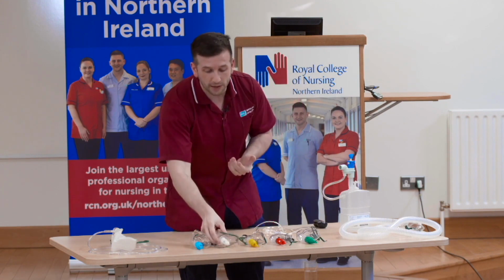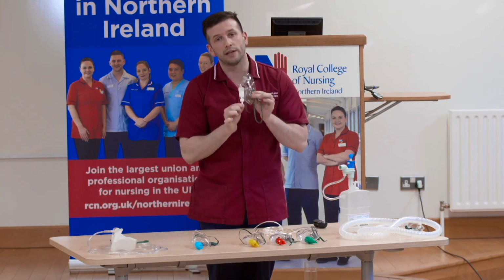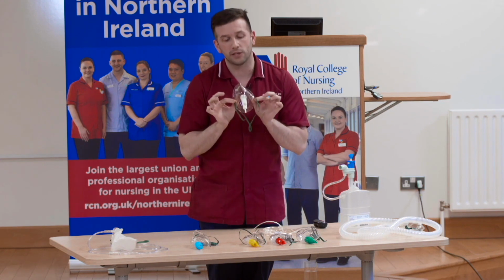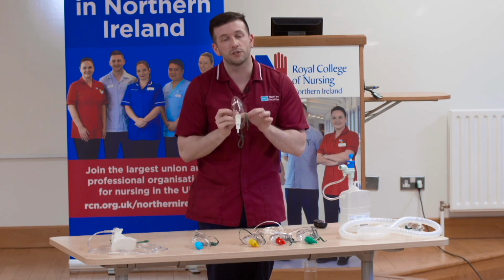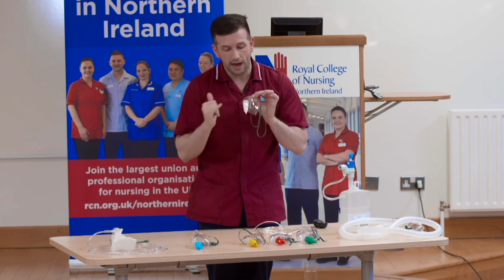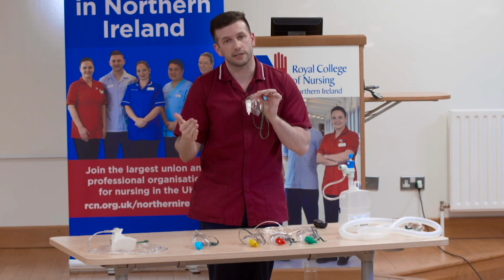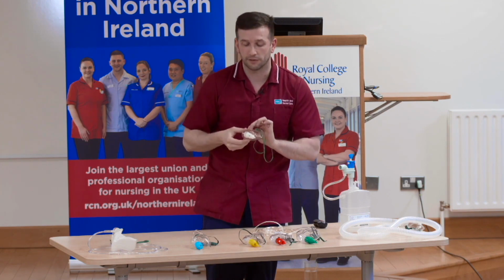An example of that would be a 28% oxygen Venturi mask running at 4 litres. If I correct my patient's oxygen saturations, but their respiratory rate remains elevated, higher than 25 or 30, I will increase the flow rate by 50%. I will go from 4 litres to 6 litres and look to see if that's made a difference.